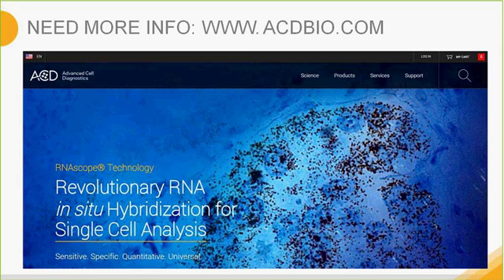One question is on the Bond RX, do we still need to use the detection kit from Leica for the new 2.5 red kit? The answer to this is yes. You will still need the Bond Refine Red kit to run RNAscope 2.5 Red.